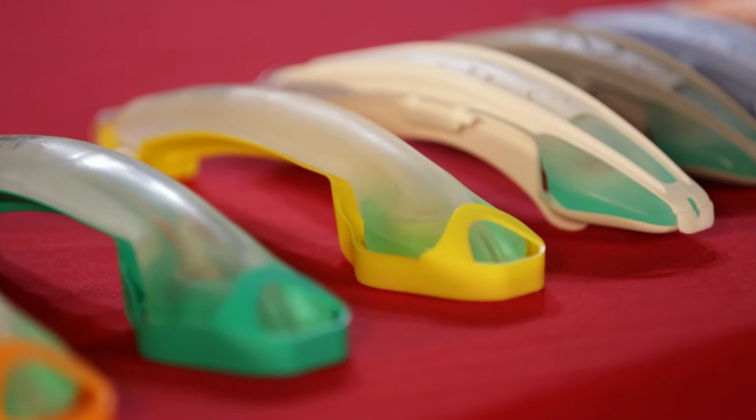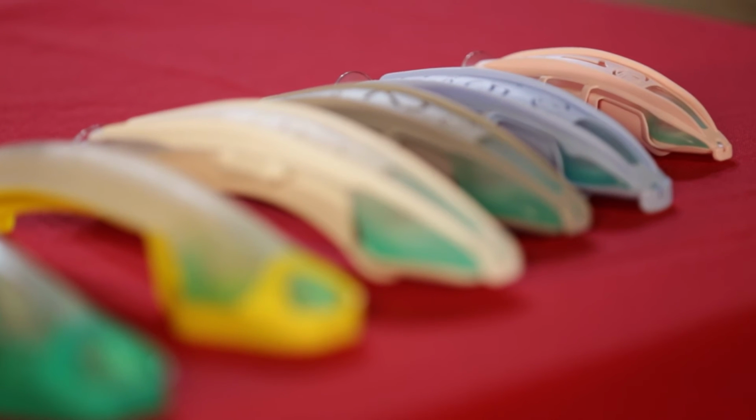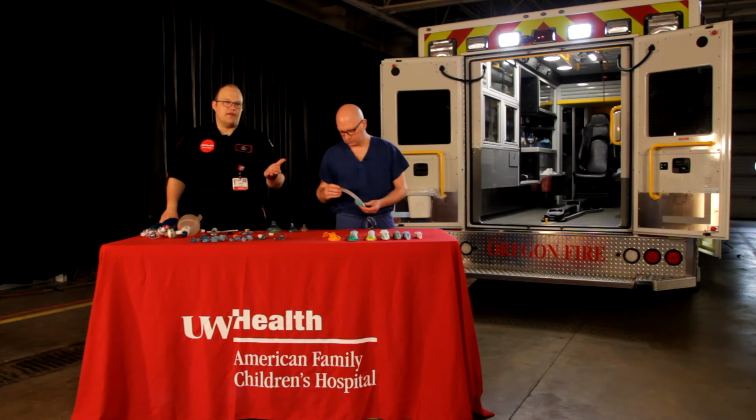And as you mentioned, there are different sizing requirements for different devices. So for example, the i-gels are going to be weight-based, and so they'll tell you on the side of the tube, on the package, on the insert, this is the size range in kilos for the patients. Know that you can estimate, but also that if you do have a Broselow, even though the colors don't match, it can give you help in determining what range of size you think.